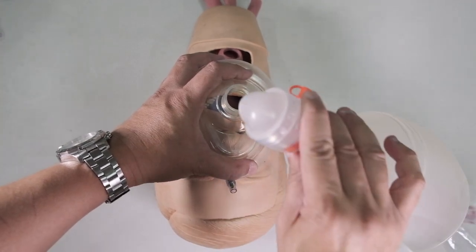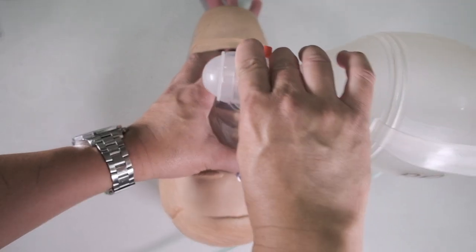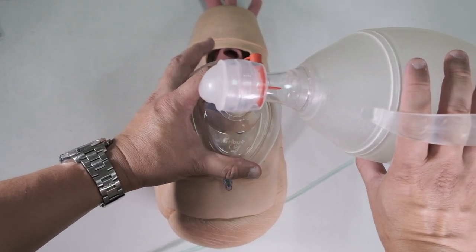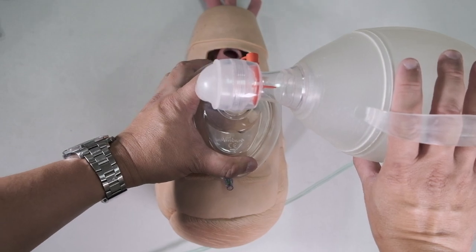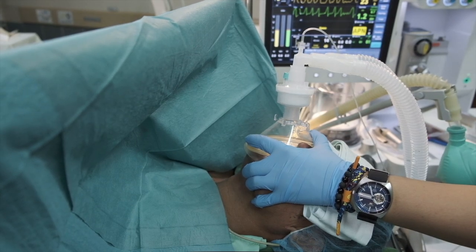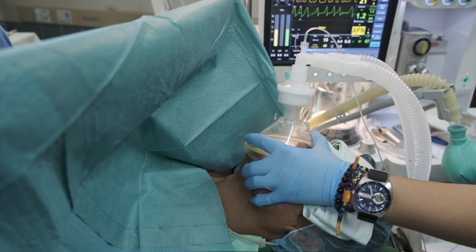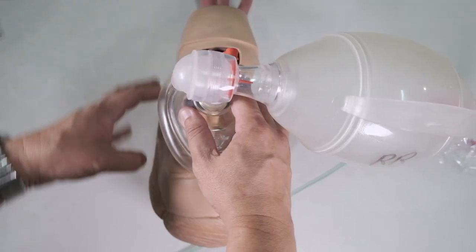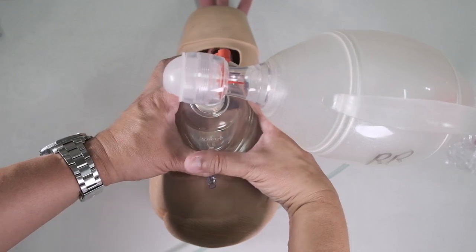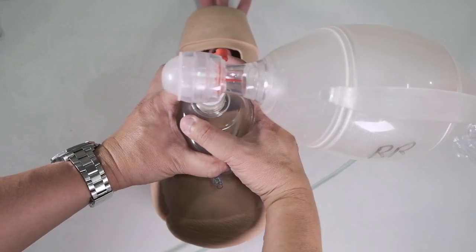The ambu bag goes through here. And then you push the C grip down, the E grip up, and then you bag. Then you bag. So make sure that there are no leaks around the mask. If there are, then you might need to shift to the two-hand grip technique, just like this, and ask your colleague to bag for you.